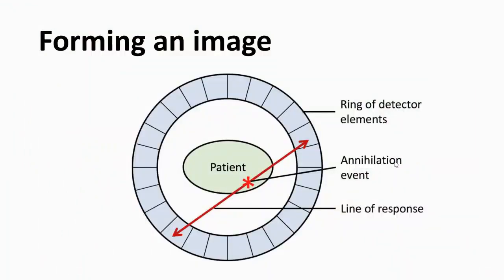Now, we talked about crystals and the radioactive material in the patient. Interactions occur, and not all photons go through annihilation, resulting in two gamma photons. We mentioned that Compton scattering can happen, and the detector may not detect both gamma photons from the same location.